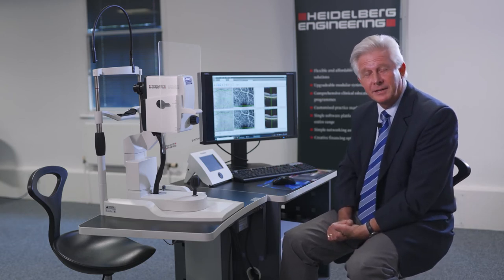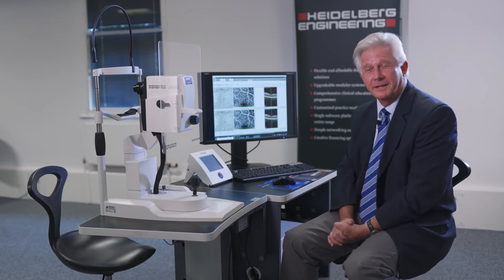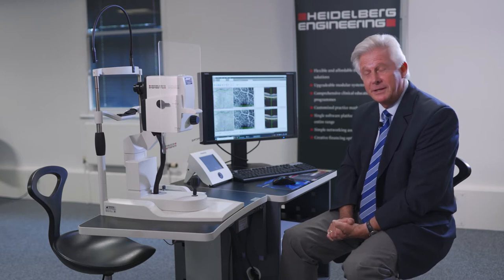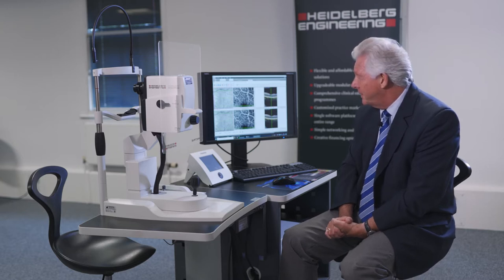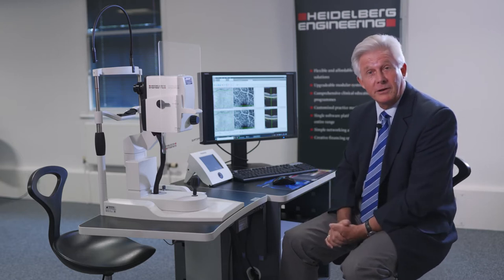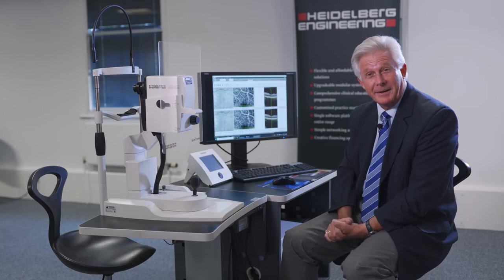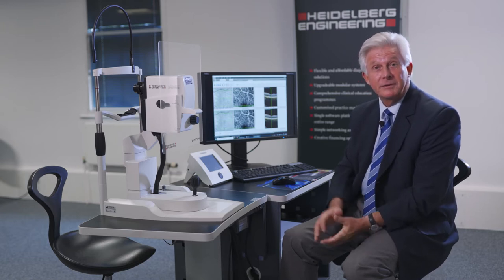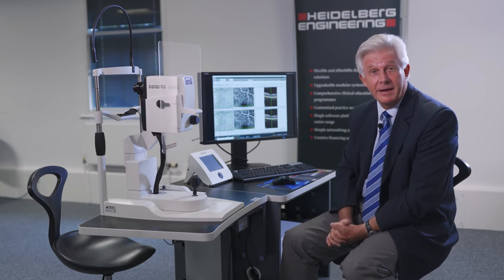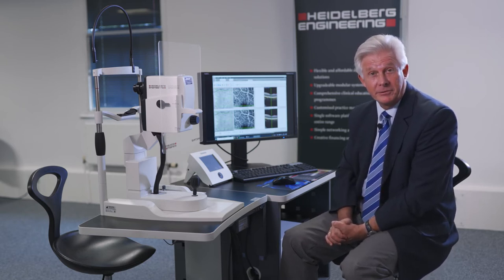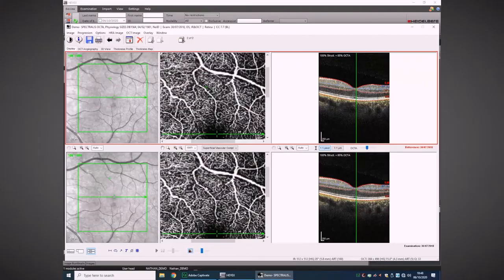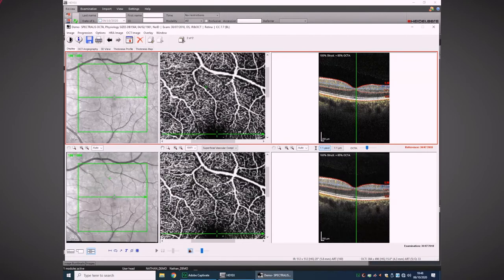Measuring OCT angiography is quite challenging, and you need these special components — what we call Spectralis DNA — TrueTrack live eye tracking, and the ART of OCT: sufficient sampling or averaging of that flow signal going through the capillary, plus the resolution to be able to evaluate what you're seeing in your OCT angiography.